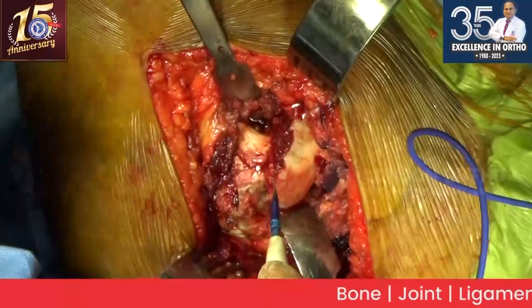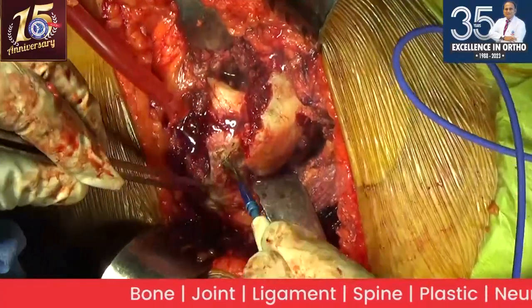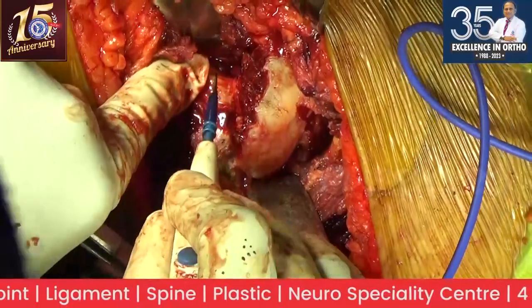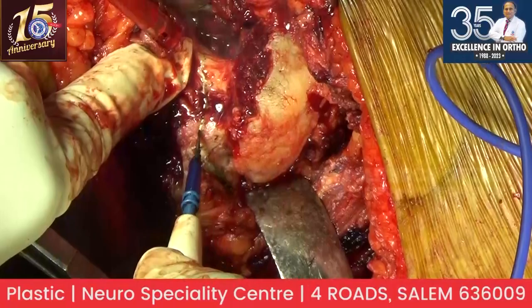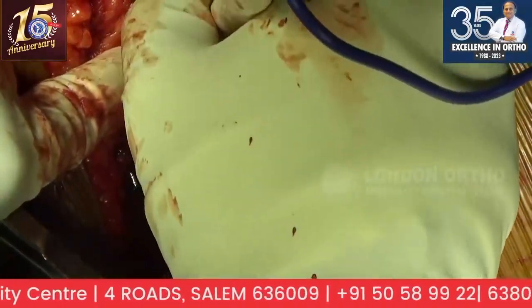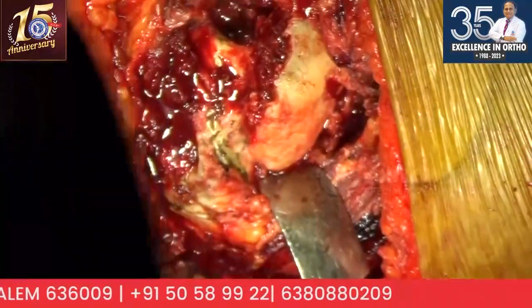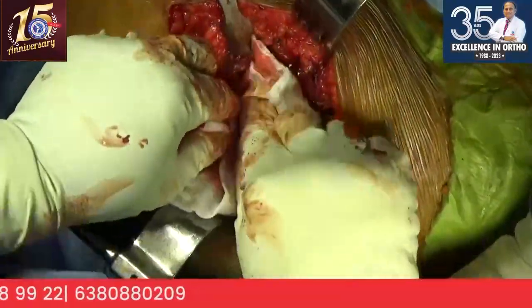Okay. So that's the greater trochanter. I can feel the lesser trochanter, so I go a finger breadth above that. Yes, I think that would be the option. So the leg is vertical, so make sure I cut it in equal anterior and posterior.